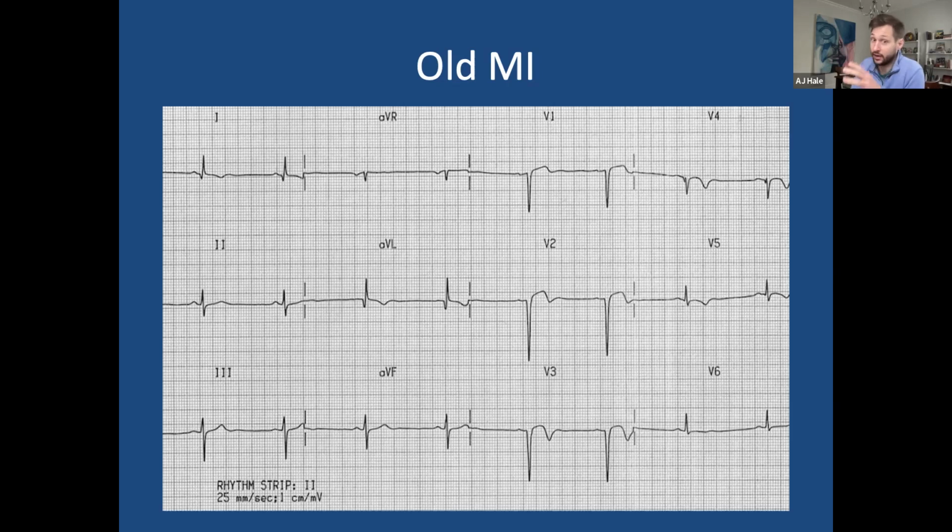How old? Sorry, I don't do caths at all. So how old are we talking about here? Anything more than 2 weeks is old. There are no reciprocal changes there. You're looking at a massive Q wave there. If you're calling this a recent MI, then there should be some kind of reciprocal changes in inferior leads, but there's nothing at all. And you've got really deep Q waves like that, with slight ST elevation. That's definitely old MI.